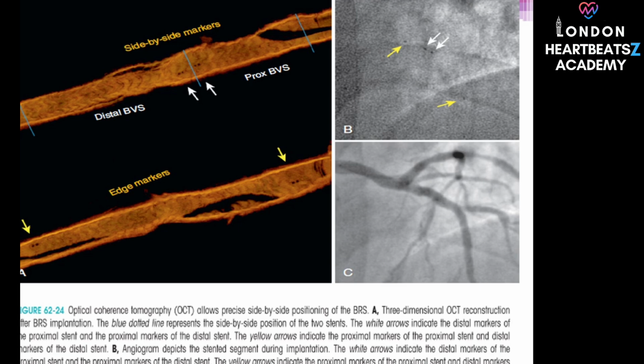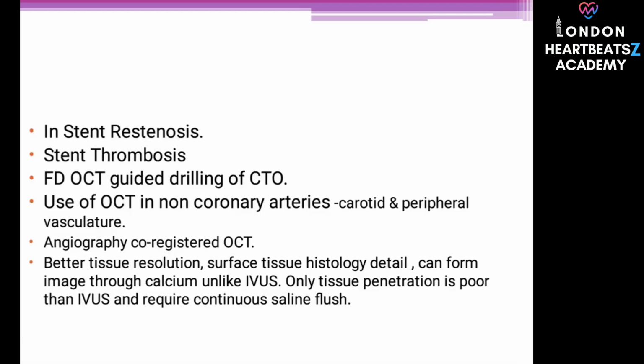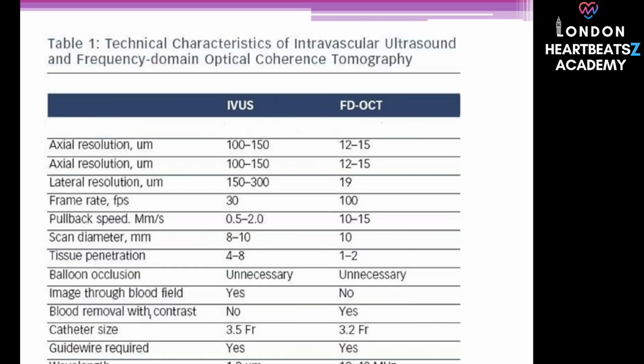Now, the review also discusses some of the clinical studies that have directly compared the use of IVUS and OCT in various clinical settings. What have these comparative studies revealed? One recent prospective multicenter study, ILUMIEN, compared quantitative angiography, FDOCT, and IVUS for coronary measurements. It found good inter-observer reproducibility for both FDOCT and IVUS, but variability was twice as high for IVUS. IVUS measurements were more variable between observers. Yes, and IVUS tended to overestimate lumen area and was less reproducible than FDOCT. The conclusion was that FDOCT provides accurate and reproducible quantitative measurements. So OCT measurements might be more consistent.